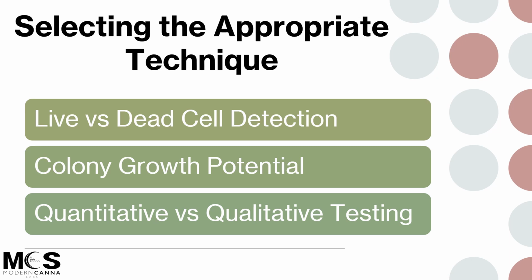So with this, arguments have been made that traditional methods are best suited for quantitative analyses, since they're going to provide results that are not based on comparisons to another technique. They're going to provide results that are a direct relationship to the quantitation.